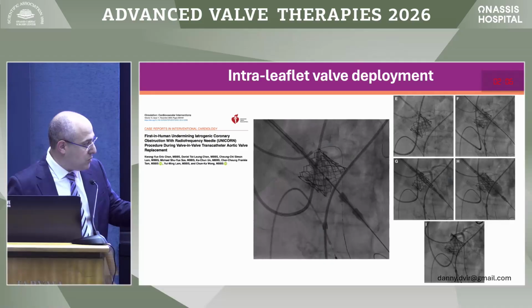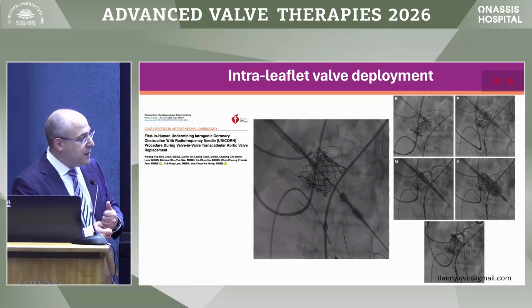It could be that adding a stent, but not behind the cage of the frame of the failed valve, through the frame. So it's not a protective device now. You have the protection, but after you do the valve, if the patient is not crashing, you bring the guide through, let's say if it was an Evolut that you used to treat, you bring it through the Evolut. What we say, this is an orthotopic implantation of the stent instead of heterotopic. Yes. There are some benefits to it, but there are risks also.